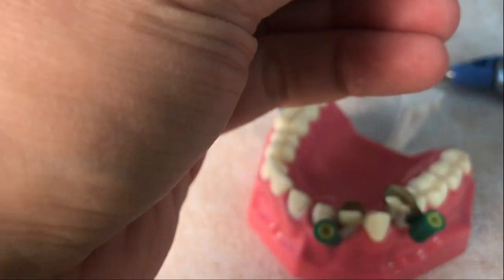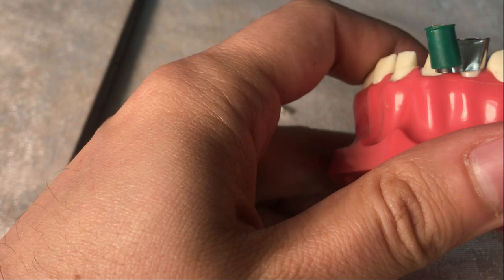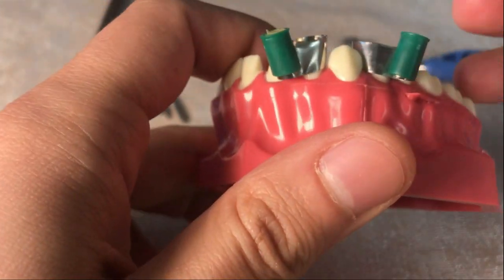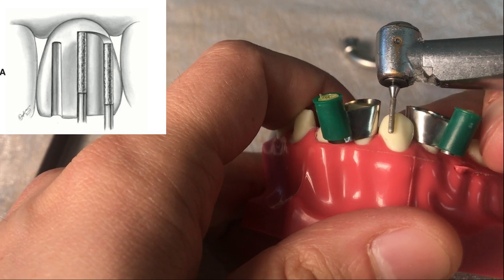We control the preparation depth with guiding grooves. If we want to make a preparation with 2 mm depth, we have to use a 2 mm cylindrical burr to form the guiding grooves.